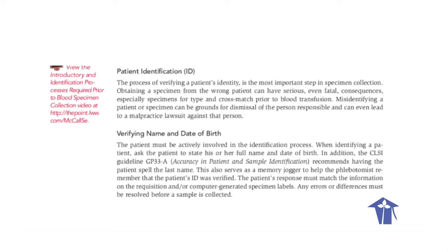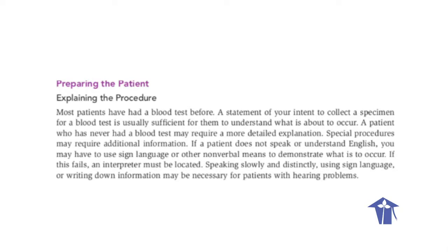Verifying name and date of birth. The patient must be actively involved in the identification process. When identifying a patient, ask the patient to state his or her full name and date of birth. The patient's response must match the information on the requisition and/or computer-generated specimen labels. Any errors or differences must be resolved before a sample is collected. Preparing the patient.